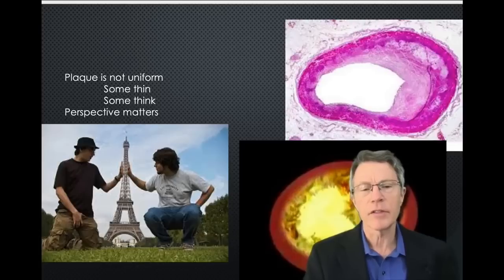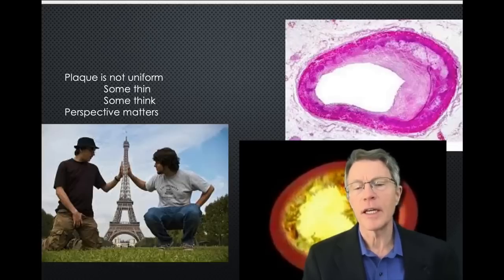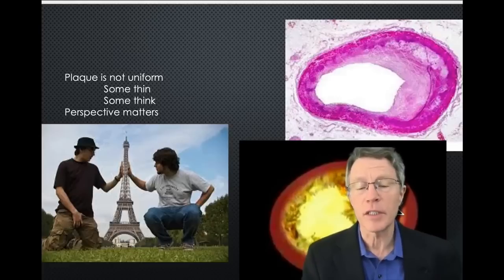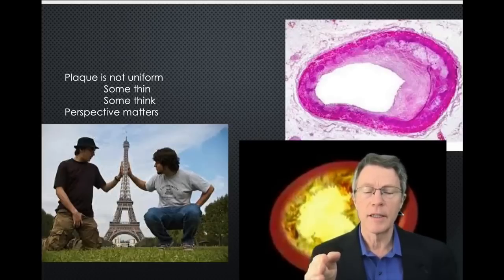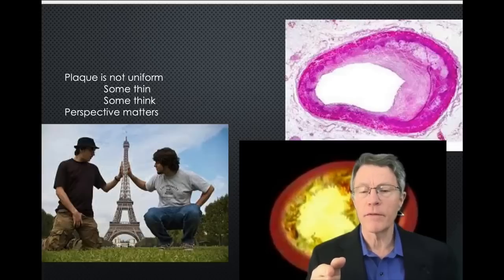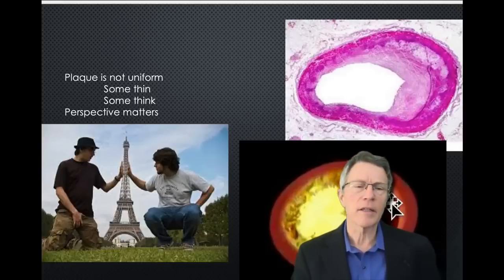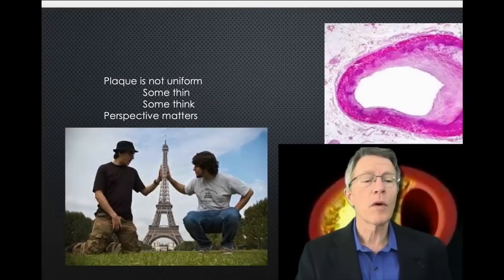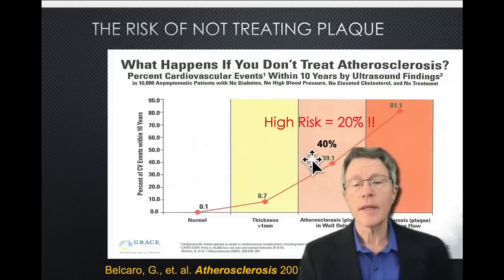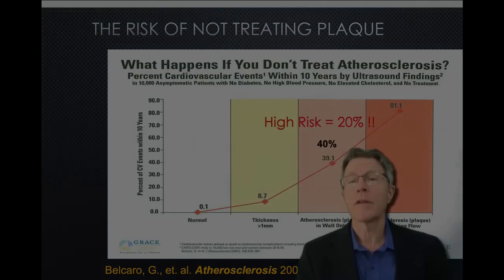It takes a lot of effort and practice and training for a CIMT to learn how to do this correctly. And that's where Todd Eldridge comes in. He does a great job in terms of teaching how to develop reliable, repeatable standards within a difficult, sometimes subjective environment. Now, again, you go back and you say, well, why not just go back to the old one? Because the old one doesn't tell us anything except whether or not we need surgery. What we want to know is, are you really at high risk? Are you at 10% risk or 40% risk? Big, big difference.